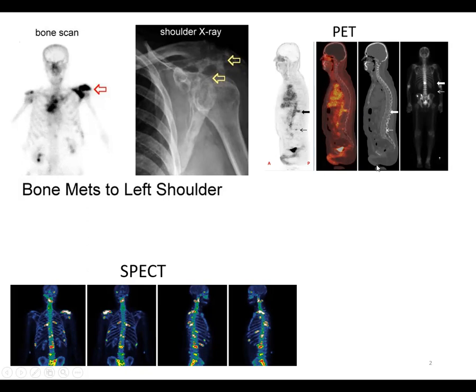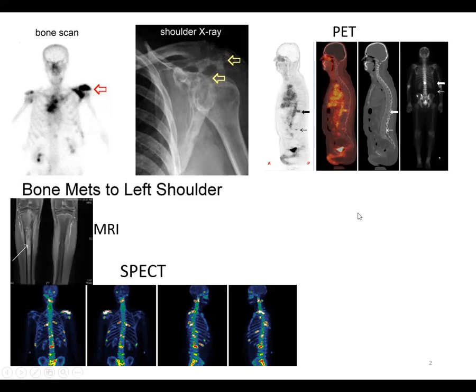On this part of the slide, we can see computed tomography. So this is a hybrid imaging type. We overlay information achieved during the PET and information simultaneously achieved during the computed tomography of the same patient during the same scanning time. We can see overlap fusion imaging, which allows us to achieve the anatomical details of computed tomography and the metabolic, functional, morphofunctional information of the positron emission tomography in order to detect tumors of the bones and other systems as precisely as possible.